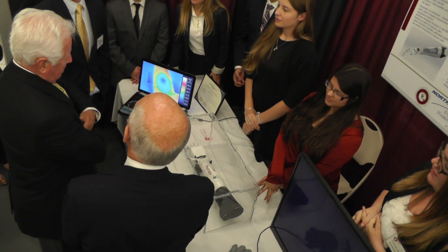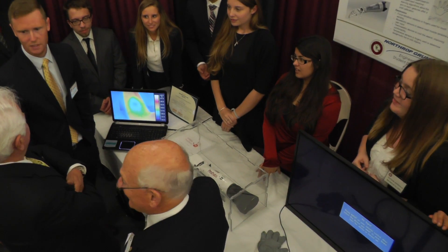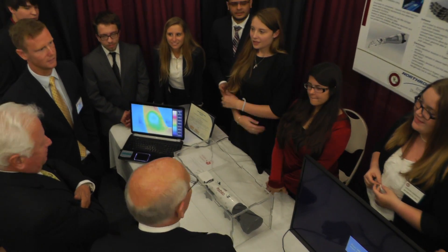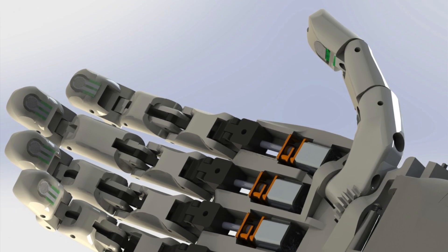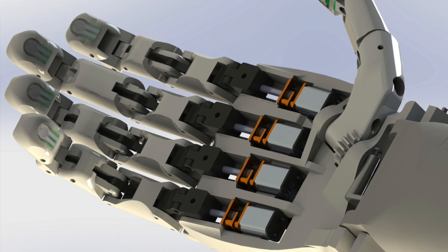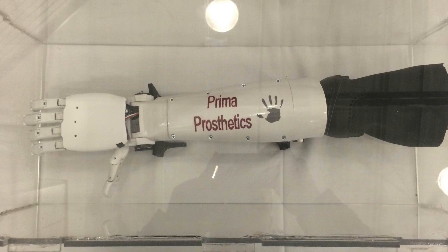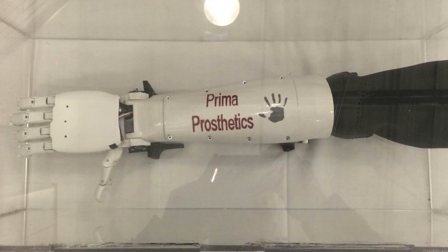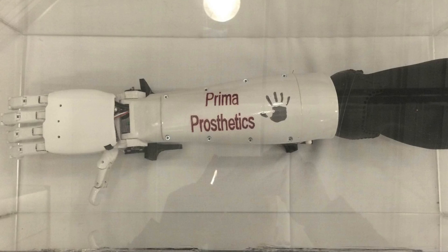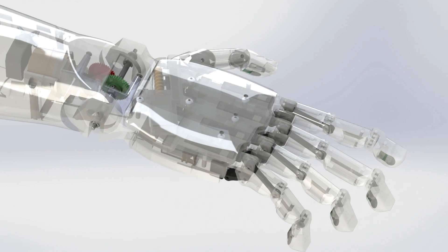The average arm on the market costs around $50,000, so if you're a child in a middle-class family being raised through adolescent years, you're looking at half a million to a million dollars as they grow with their appendages. Our arm is being offered for $1,500, which is substantially cheaper, and it still offers all the functionality of the $50,000 arms plus touch sensing, so they can feel what they're touching and understand how to work with the arm.